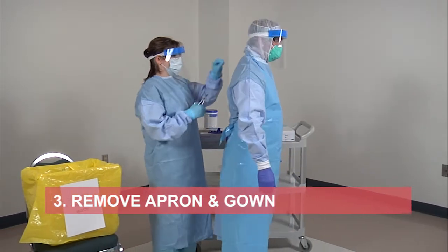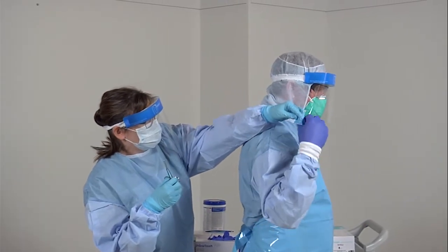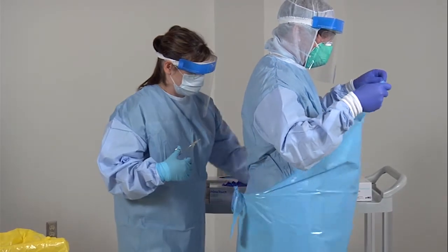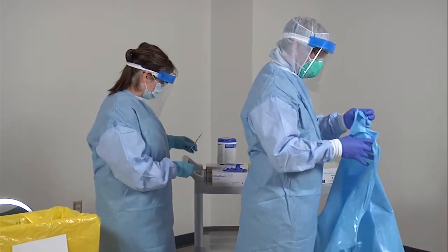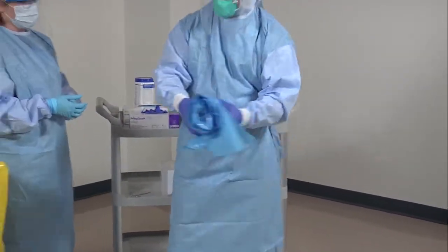The quality monitor will help you remove your apron by cutting the apron neck and waist tie. Pull the apron away from your body and fold inwards onto itself, rolling it away from you until it becomes small enough to discard. Discard into the waste bin immediately.